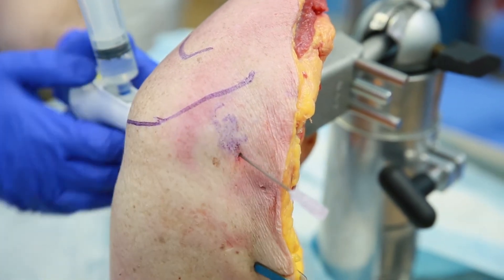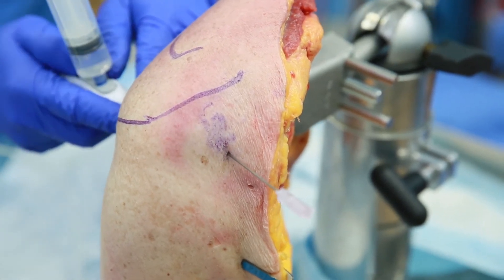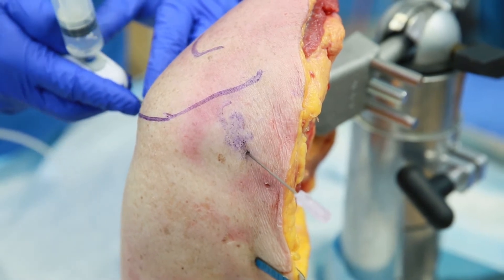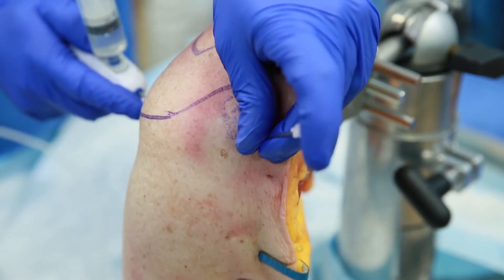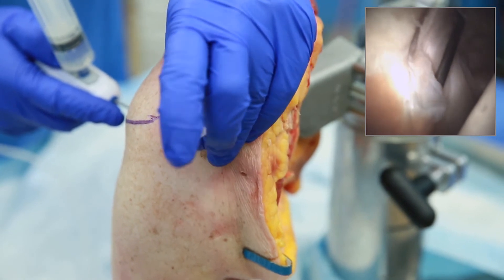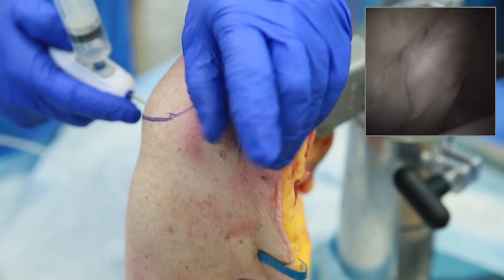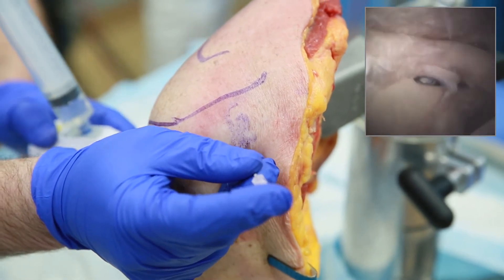I'm back inside the joint and there's my rotator interval. Now I'm in with my spinal needle. So now that I'm in here, I can palpate and tell — is my labrum torn or not torn? Is it peeling off? Am I able to elevate things up and off? Do I want to go ahead and look at my biceps tendon, which is going to be on the left side of my screen here?